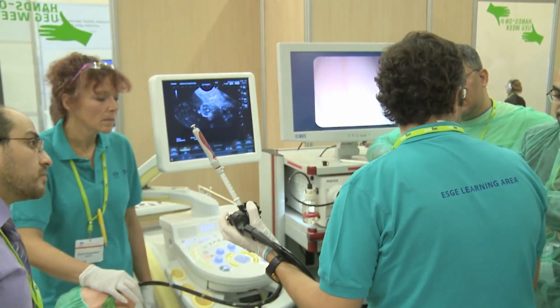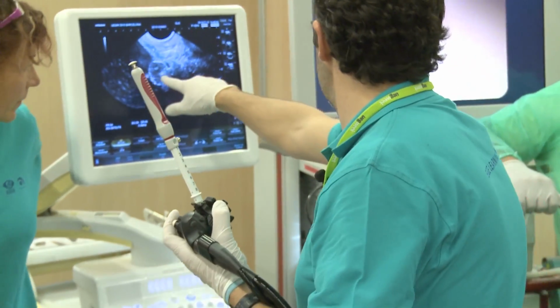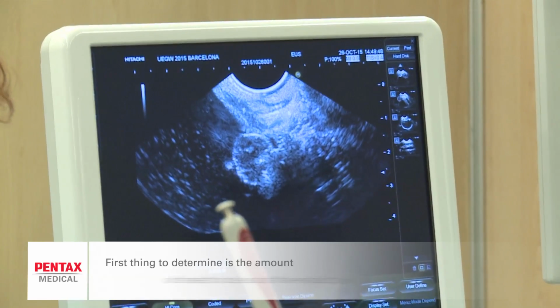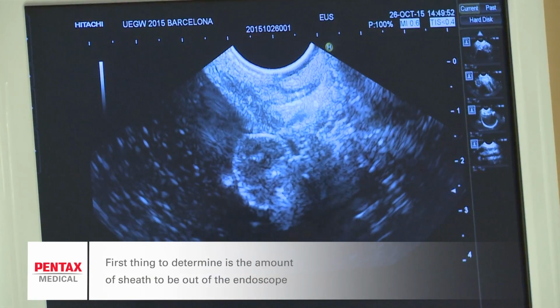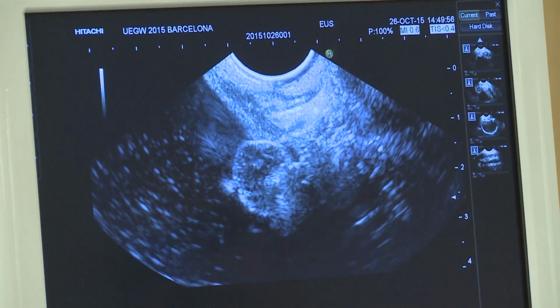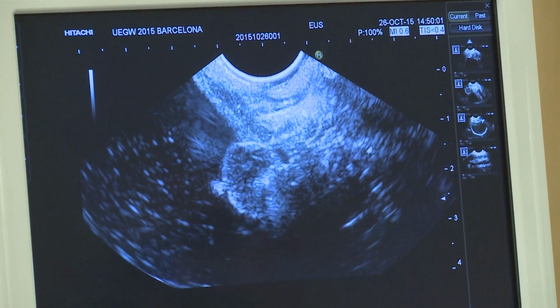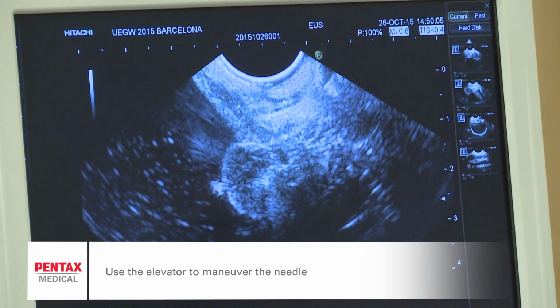Okay, now it's time to start. Okay, so time to start. We have a target lesion. Okay, so the first thing is to see the amount of sheath we want out of the scope. So we release the first wheel, okay, and we put this out. And you see by the EUS image that this is coming. Okay, I will use the elevator to see how it's coming.